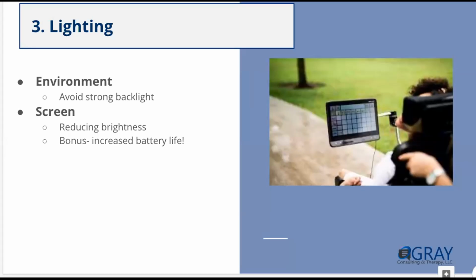There's lots of infrared light when we're outside, and it detracts from the quality of the reading. The newer cameras do a significantly better job. However, a lot of users still have the previous cameras, right? And some cameras are better than others.